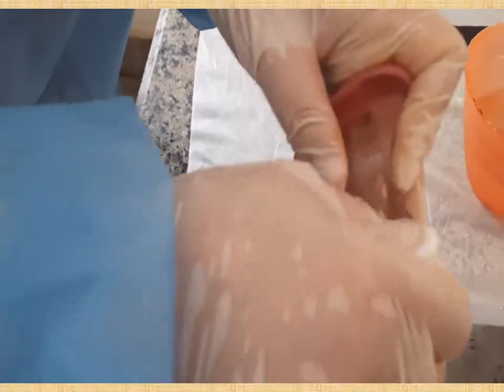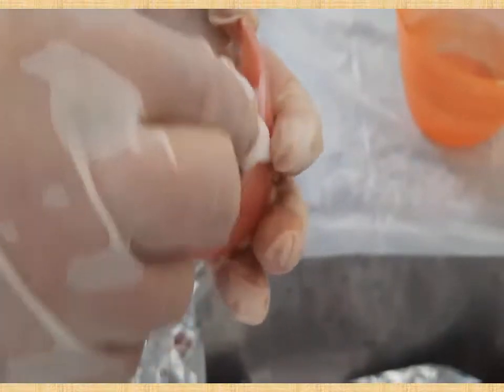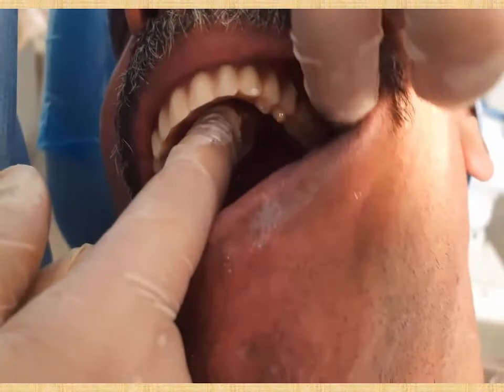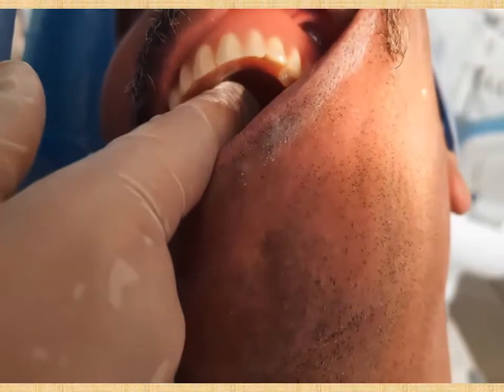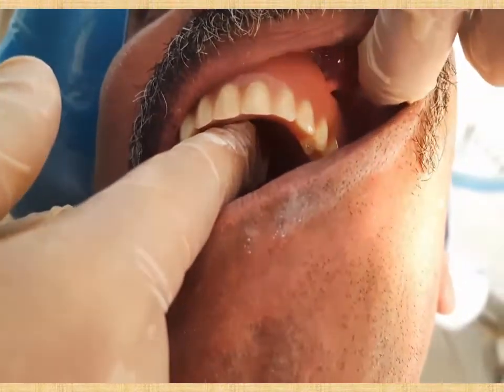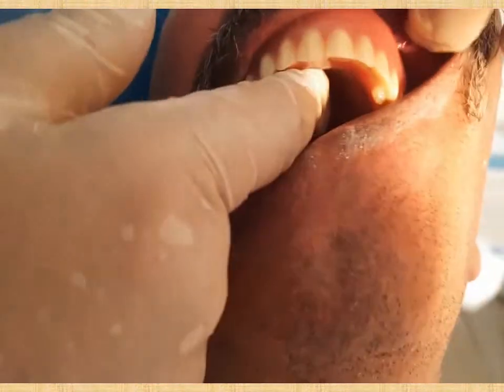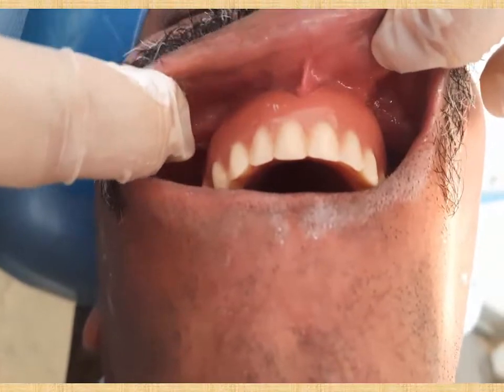Use a small piece of cotton to remove the white paste and clean the denture to check if sufficient reduction was made or if more height needs to be removed from the flange. After reduction, ask the patient to slowly open the mouth — a small space should now be created at the 45-degree reflection. Check all frenum openings: buccal frenum, labial frenum, and the other buccal frenum. All frenum spaces for the upper arch should be open in their correct positions.